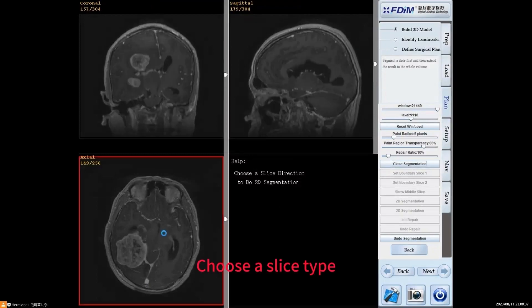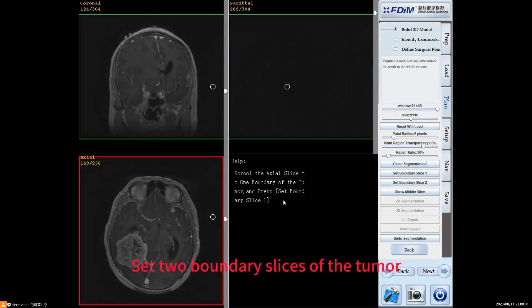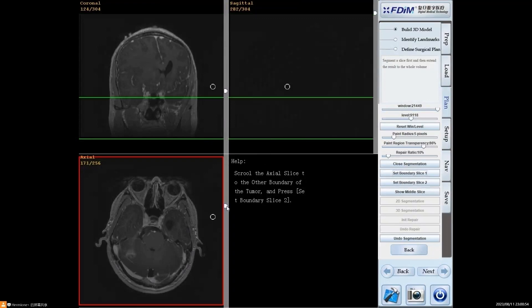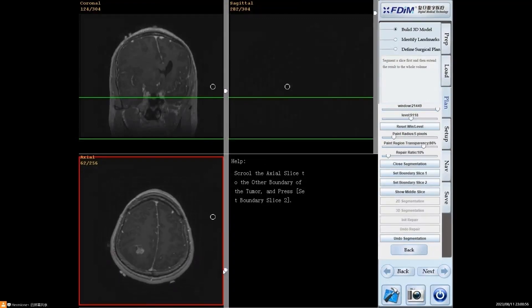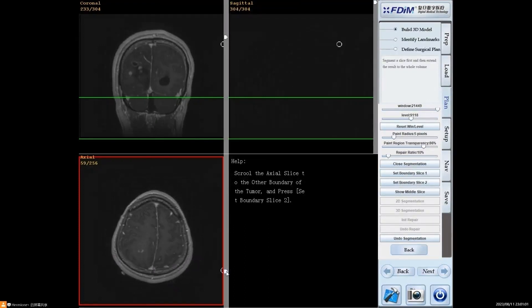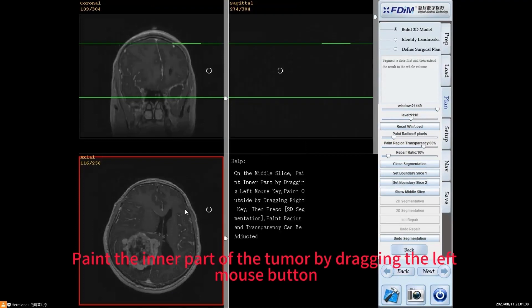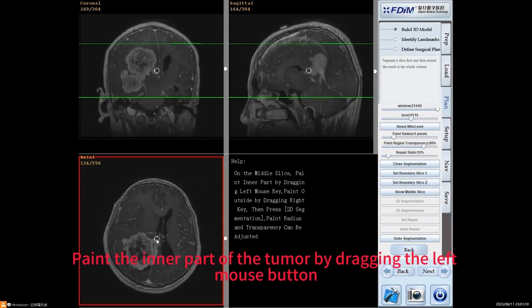Use a slice type to set two boundary slices of the tumor. Then set another boundary slice to define the tumor extent. Paint the inner part of the tumor by dragging the left mouse button.